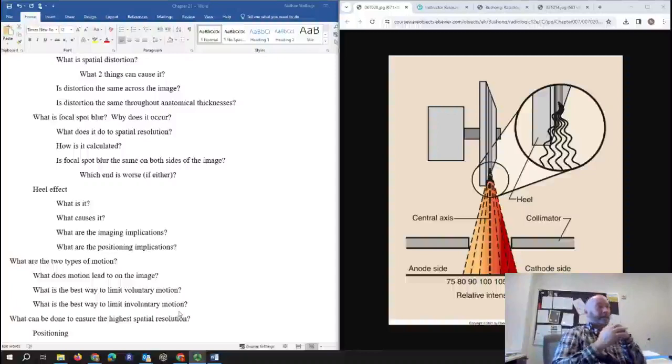We talked in class today, what if you're working with an imaging system that has limited options, if you're working portables? How can you decrease your time? Well, then you would have to increase your kVp. If you are phototiming, you can increase your kVp. And again, normally we want to change our mAs for things that we don't need to change our differential absorption for.